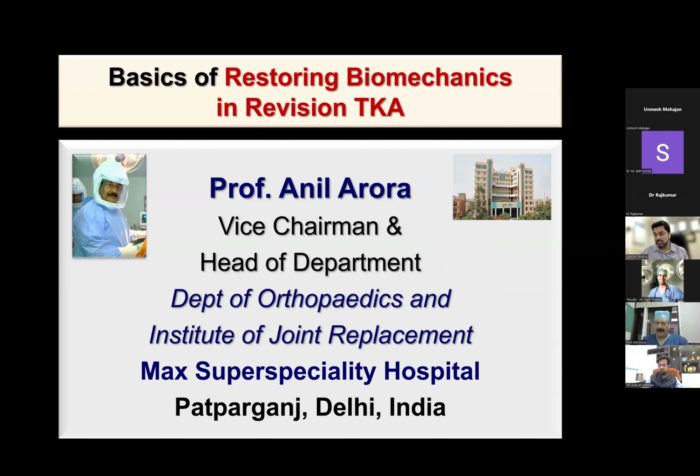Thank you. Apologies for all this because I'm in the OT and the signal issue is there. Restoring biomechanics in revision total knee arthroplasty is in fact a three-step process. First, you establish a stable tibial platform as step one.